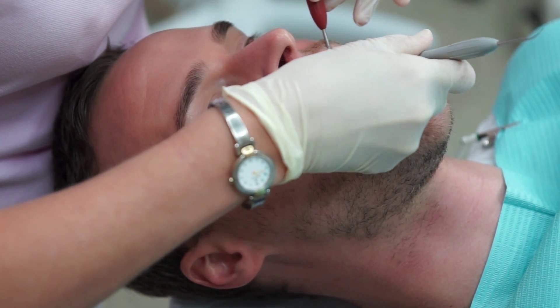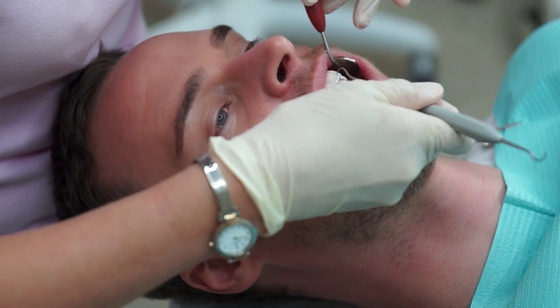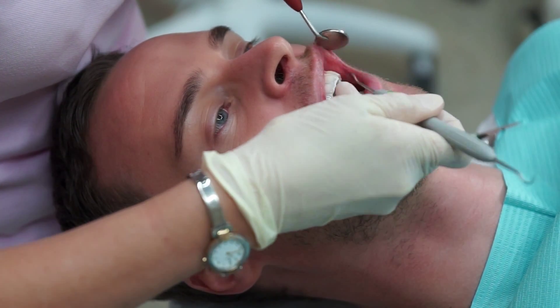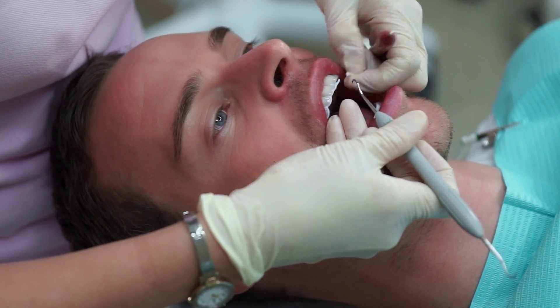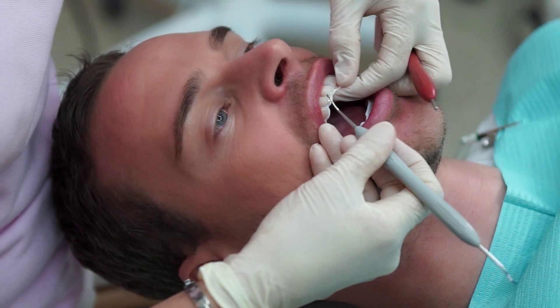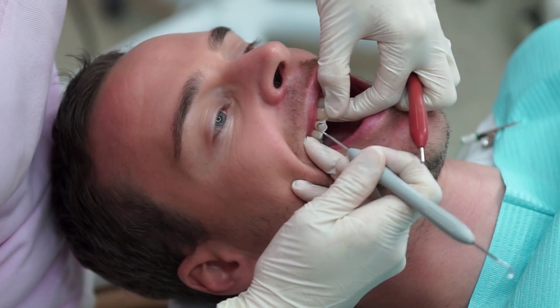Once all three cycles are complete, the protective layers on the incisal edges of the teeth and along the gum line are removed. It is specifically important to also isolate these incisal edges because if not done properly, it can cause hypersensitivity.